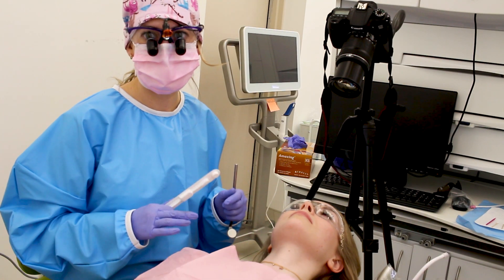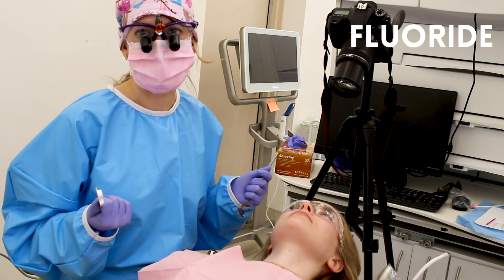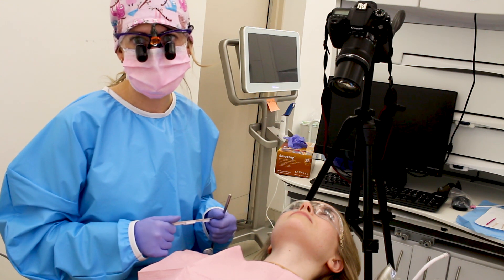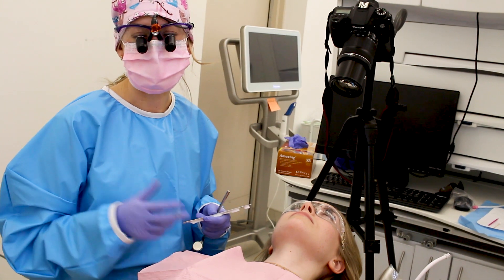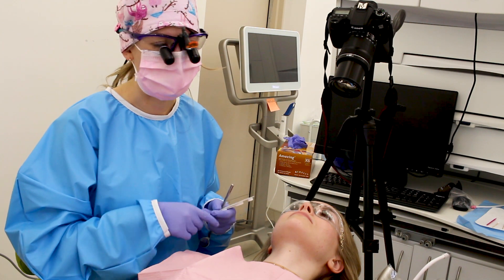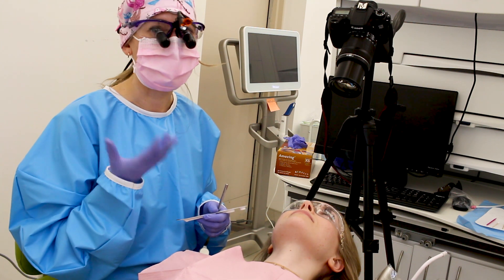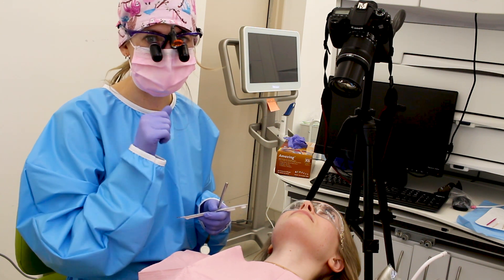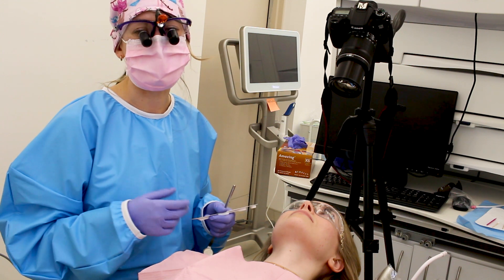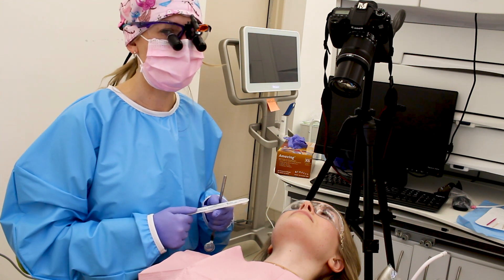The final step after cleaning, polishing, and flossing is fluoride. We use fluoride varnish — I like it because it goes on really easy and most patients don't mind it. It's a little sticky afterwards and feels tacky on your teeth, but it's not the rinse which gives a lot of people an upset stomach, and it's not those tray systems you had to wear as a kid where you'd sit there drooling for a minute. You can't rinse after — the one downside is we actually want it to sit on your teeth and soak in for at minimum 30 minutes, with manufacturers recommending about two hours.